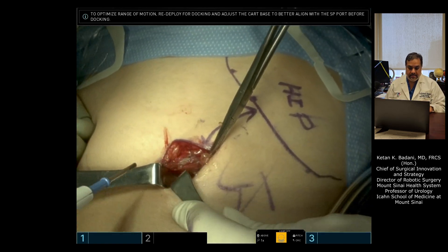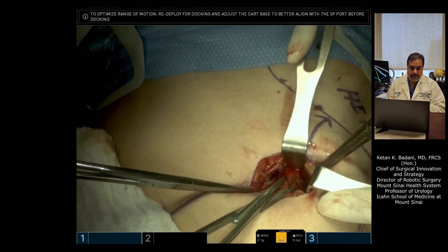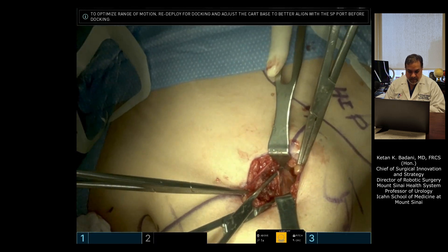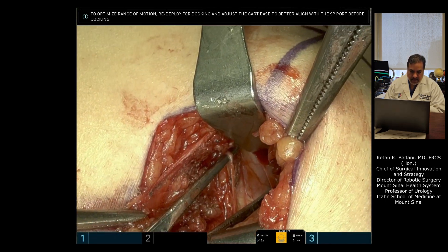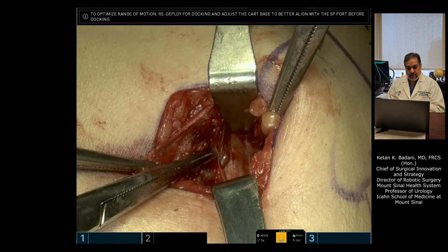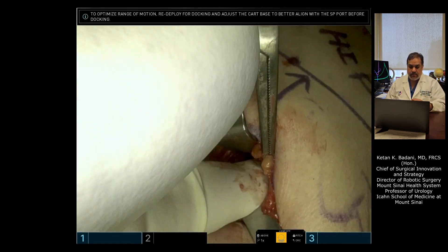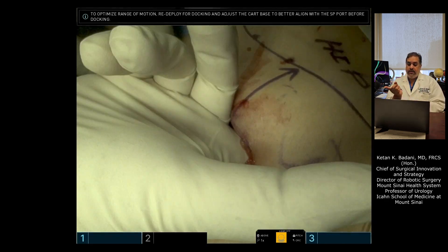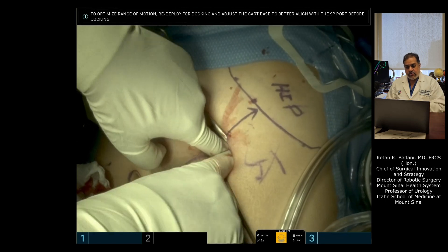This is a true single port access — no additional ports in the abdomen or retroperitoneal space, no plus ones. Here you're going to see the transversalis and peritoneum separation. This is exactly the sweet spot: peritoneum on the left, transversalis on the right — that is the plane. You can see I'm pointing towards the hip. That's peritoneum. If you push straight down you will get into the peritoneum, so instead put your finger in the space, go to the hip, sweep the space open, then rotate and bring it all medially, pulling the peritoneum medially.